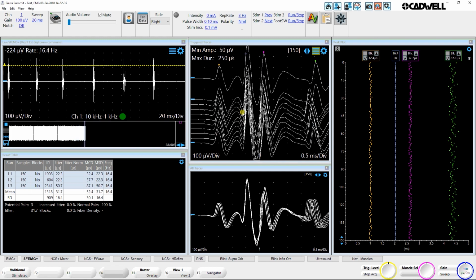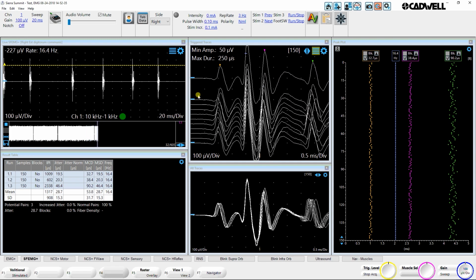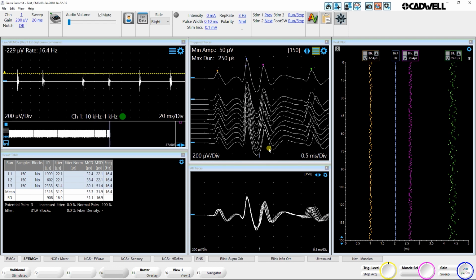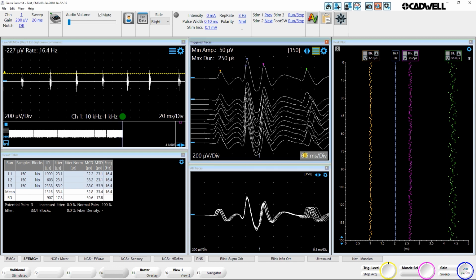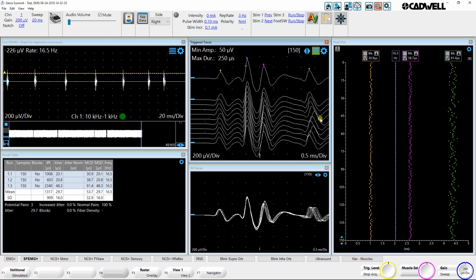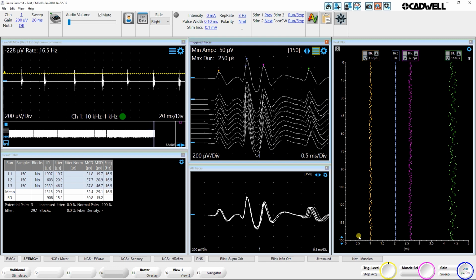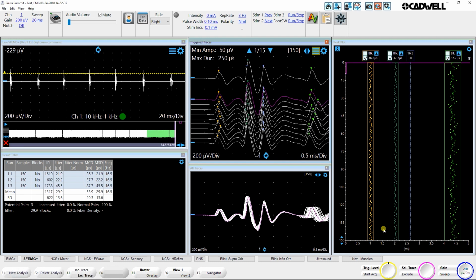And then in our trigger traces window, you'll see that motor unit displayed along with all the peaks that we are automatically detecting. We can use the blue knob to turn down the gain if we want to. The sweep can be changed by pushing down the blue knob, or actually for this window we could just increase or change the sweep that way to make sure we're getting all the peaks. So here we're seeing 4 peaks cascading down, and we have at least 150 samples of each, so we'll go ahead and stop that acquisition, just hitting the switch, the yellow knob, or the run stop.